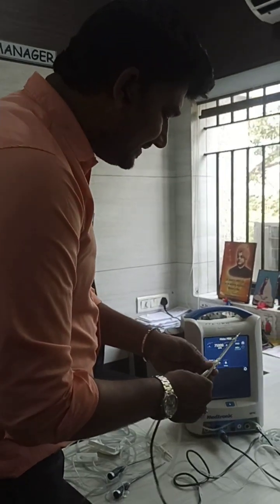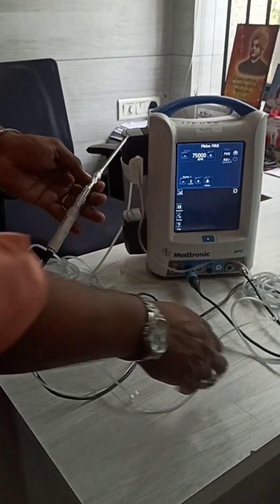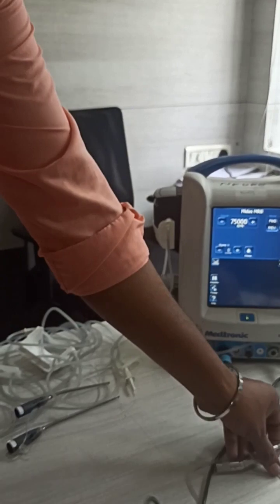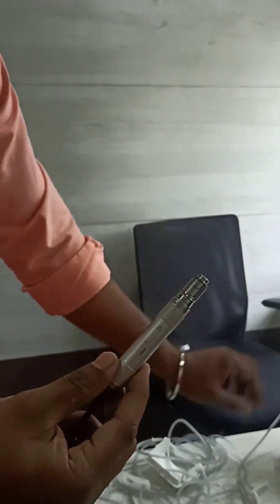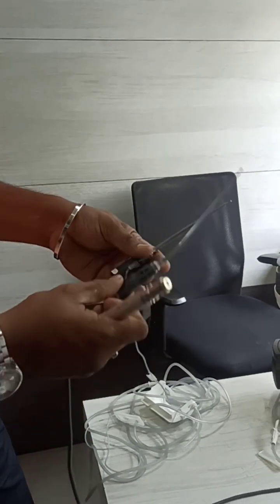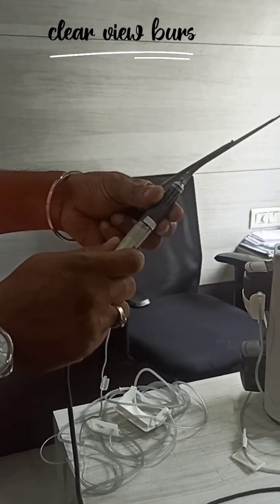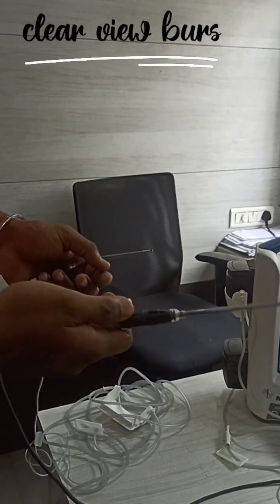To avoid this difficulty, they designed another tool - an advancement. This is the motor and this is the console. Here you can see the clear view burr. The advantage here is there is no need of a separate attachment - straight away you can connect this tool, lock it, connect the irrigation tube, and use it directly.